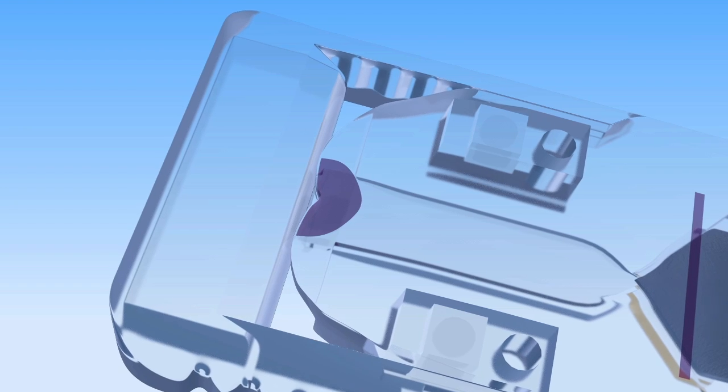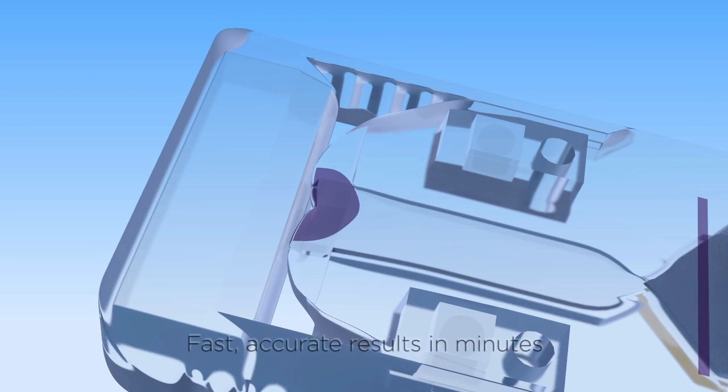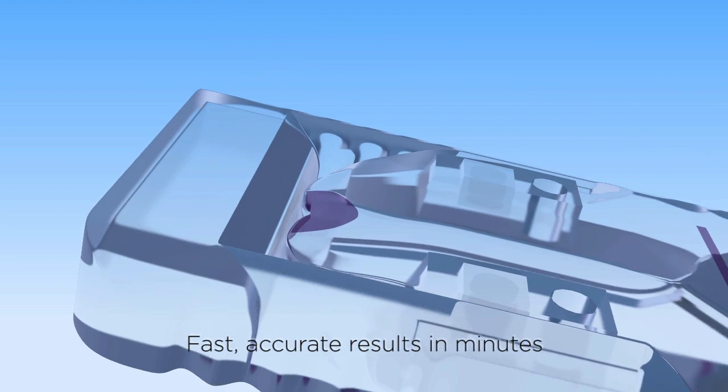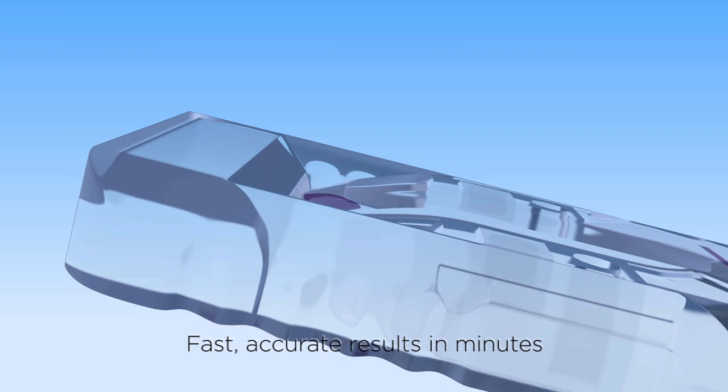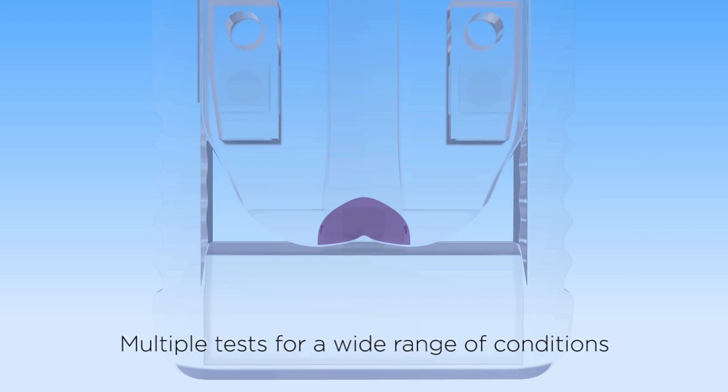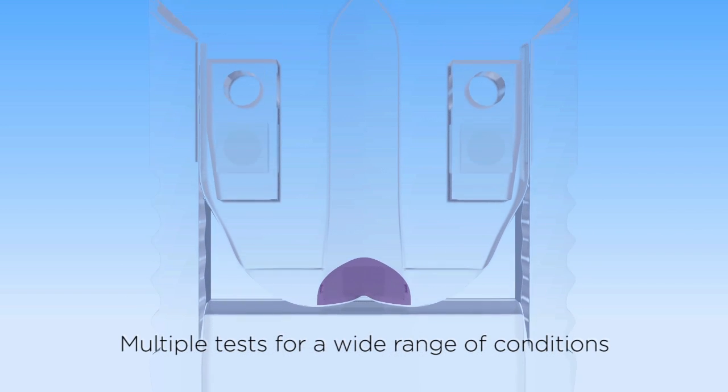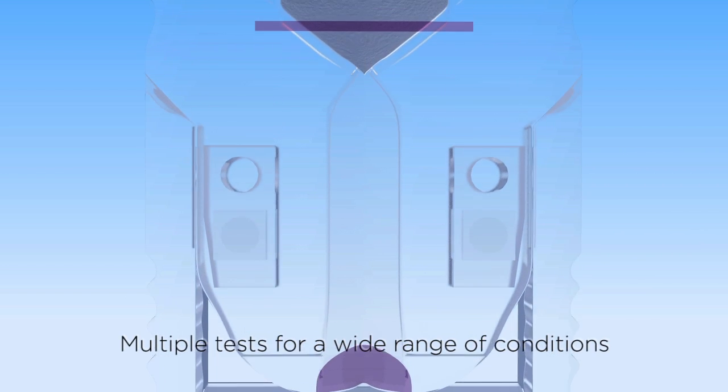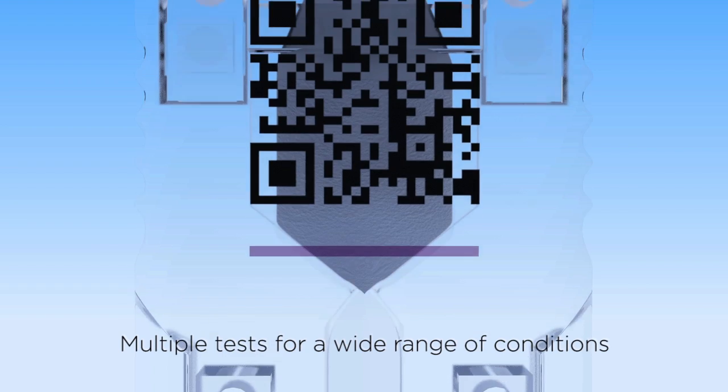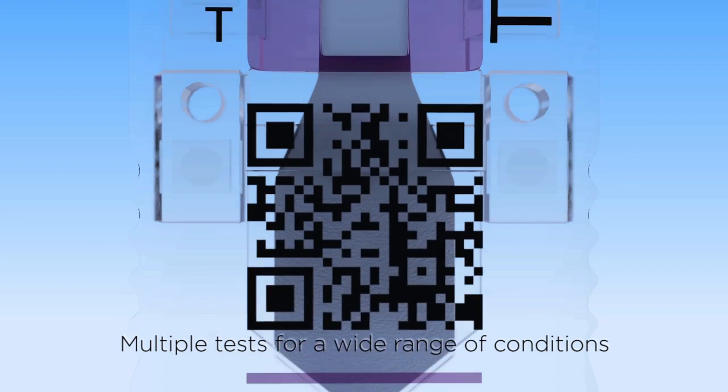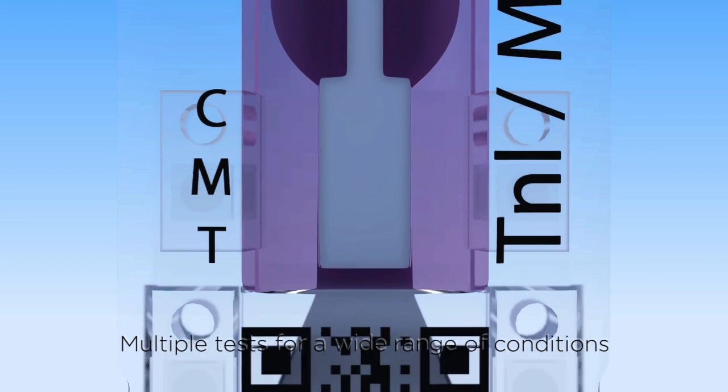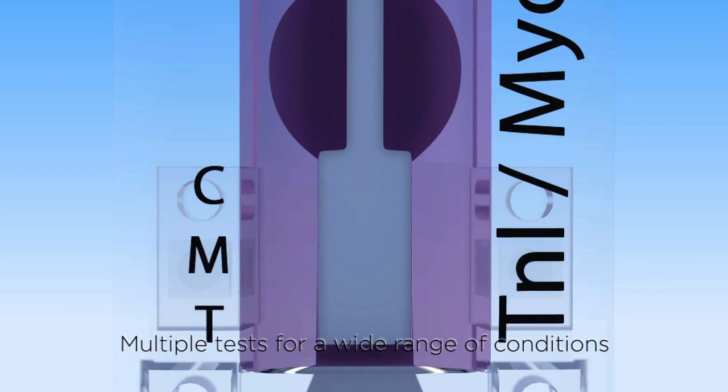Adexis DX delivers accurate results in minutes, not hours or days. Due to its revolutionary design, Adexis DX makes lab-quality diagnostic testing possible on-site for a wide range of medical conditions and diseases.